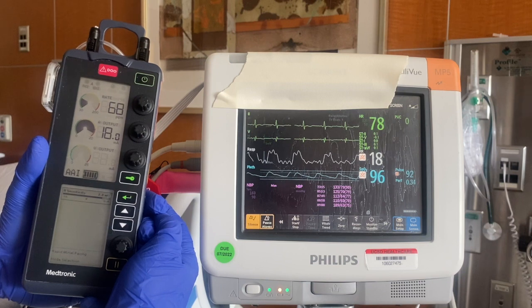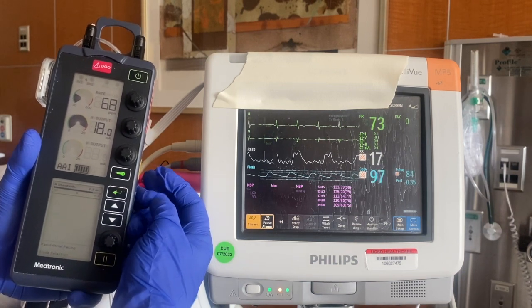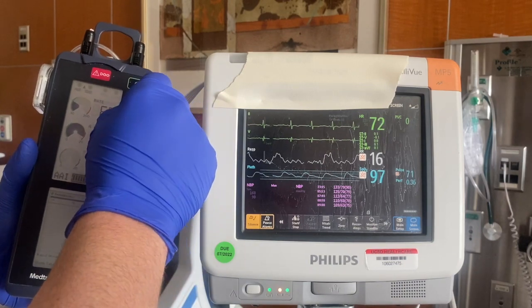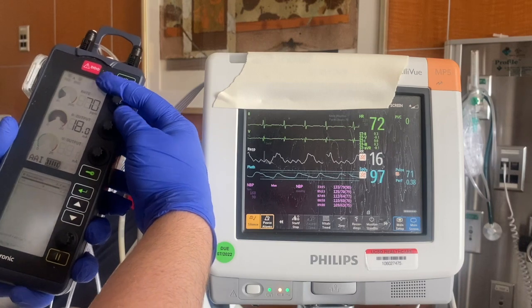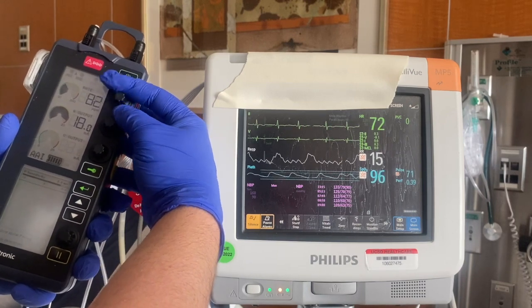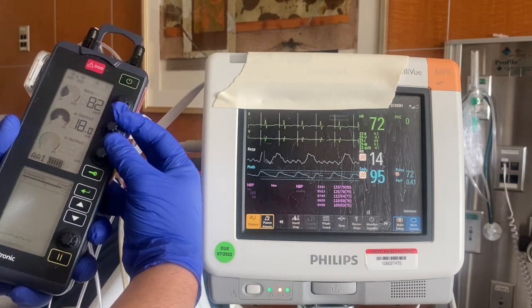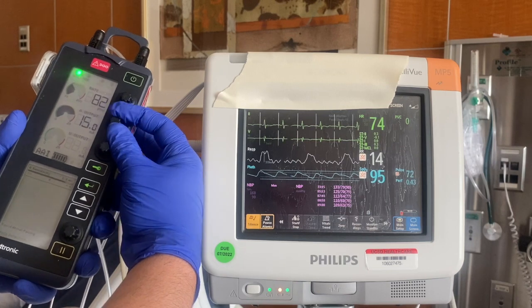The next step is the stimulation threshold. You want to set the pacemaker at a rate 10 above the patient's intrinsic rate. In this case his heart rate is 72, so we will go up to a heart rate of 82. We're going to decrease the milliamps by turning the output counterclockwise until you lose capture.